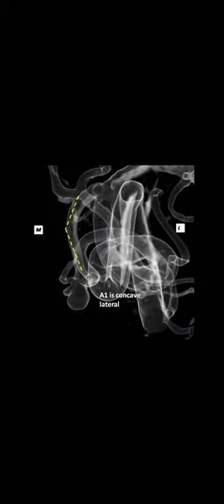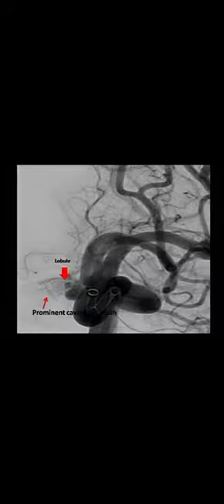And as you can see, the aneurysm has an angle to the artery, so we needed a particular shape to enter the aneurysm. But in the other angle we see that the aneurysm is at a slight angulation to the artery, as seen in this image. This is the parent vessel direction, and the simple curve here will not work because a simple curve will point into the parent vessel. So we need something more perpendicular.